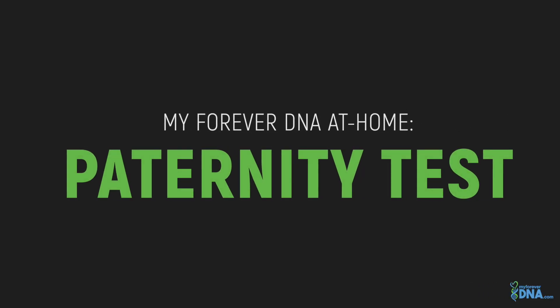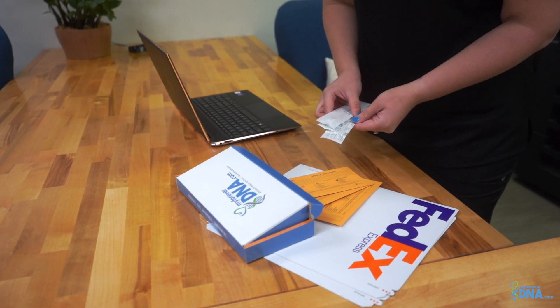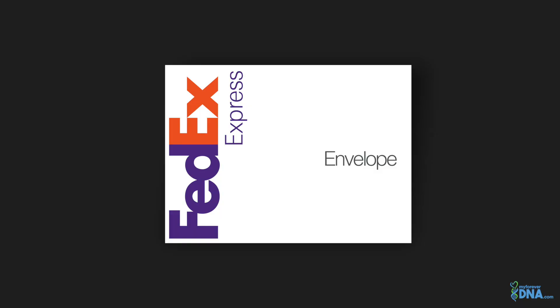I will be explaining how to properly collect your DNA samples for our complete at-home paternity test. We know privacy is of the utmost importance. Your MyForeverDNA kit will arrive in discrete packaging so no one knows what's being delivered.